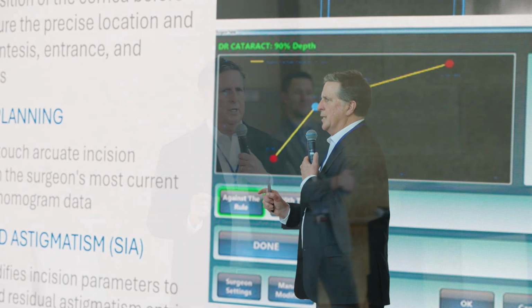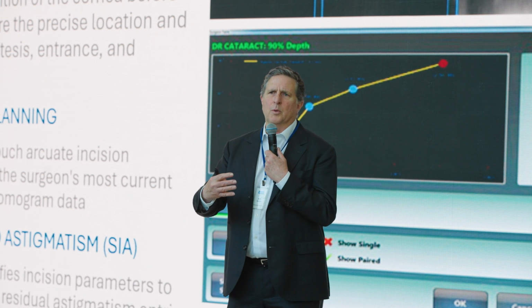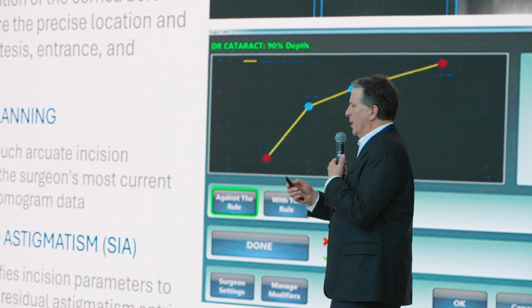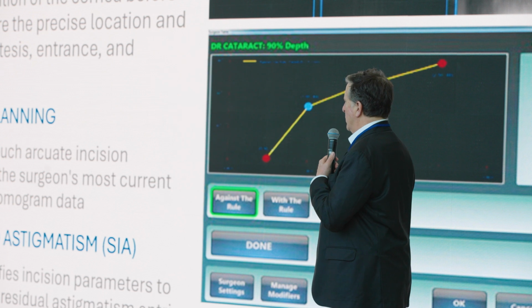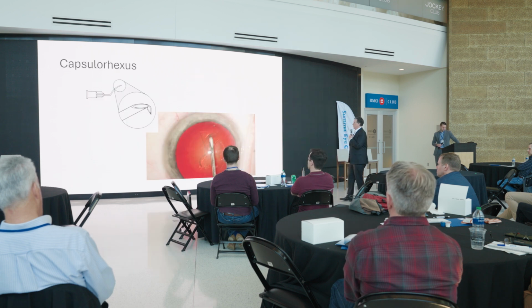We can treat a quarter diopter of astigmatism regularly. We can treat up to about a diopter and a quarter, which is where we'll draw the line and say, all right, that's where relaxing incisions, that's the sweet spot. Anything above that, we offer a toric implant. And so these are the types of parameters that we know we can use to get the best possible quality of vision. And so if you want to use just a toric implant, that's absolutely the way we use this laser. If we use the light adjustable lens, again, we just have that next level of exquisite control.